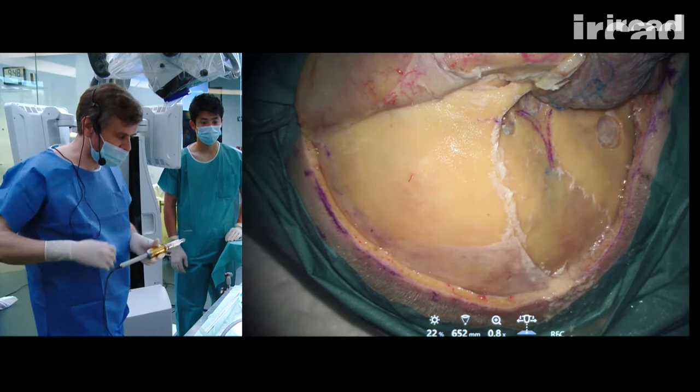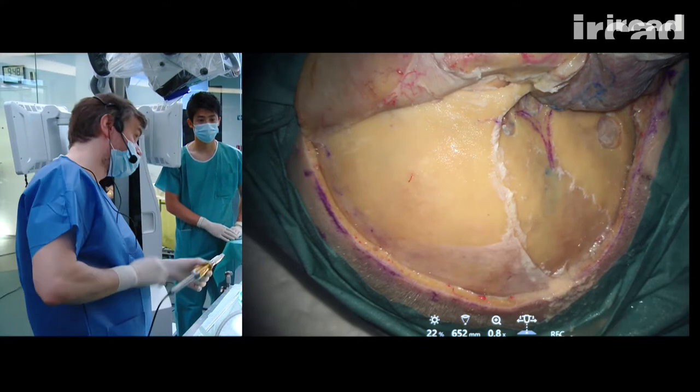An additional burr hole here in the frontal area.